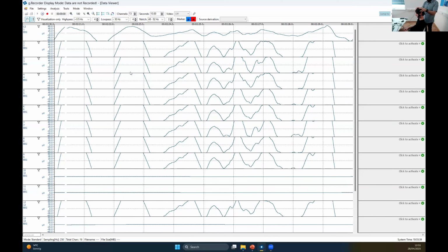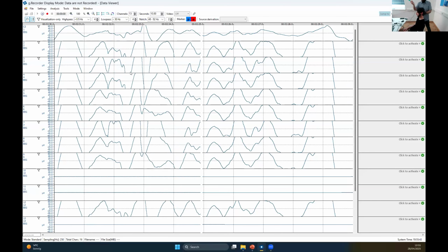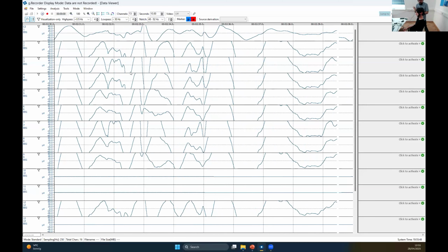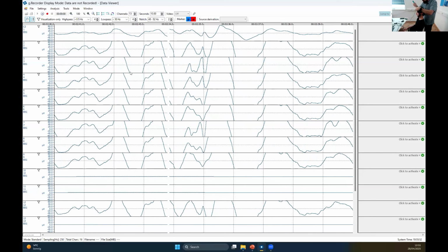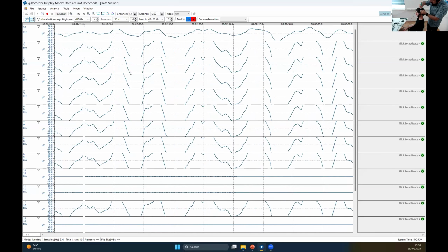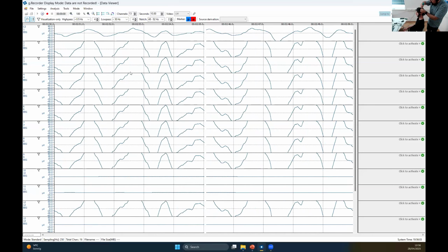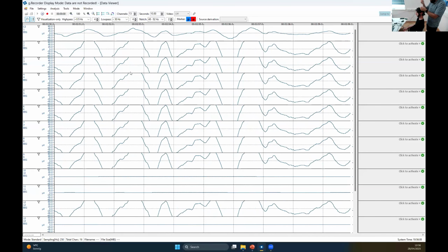And we have, in this case, the gel. In this case, we have the syringe. I'll apply a bit of gel into the earlobe reference, applying a bit of gel in the ground, and then one by one, a bit of twirling around so that the tip can reach the hair. Let me see.